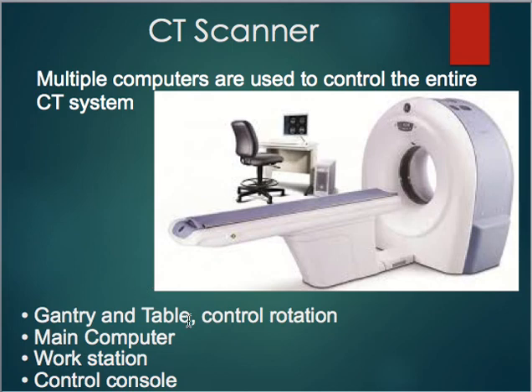There's a main computer, a workstation, and a control console. The main computer can control the operation of the entire system. There's also a dedicated computer that can reconstruct the raw data into an image. And then there's a workstation that usually has a mouse and a keyboard that allows the technologist to control and monitor the exam. So picking the correct patient, the exam that we're doing, setting everything up.